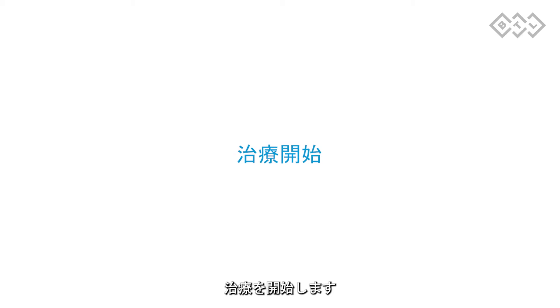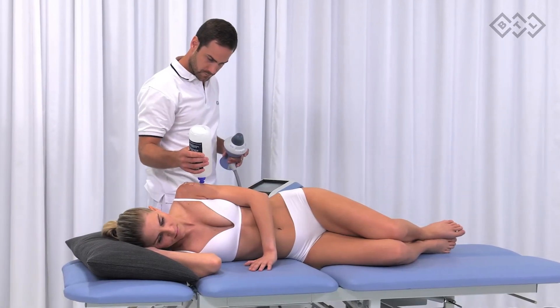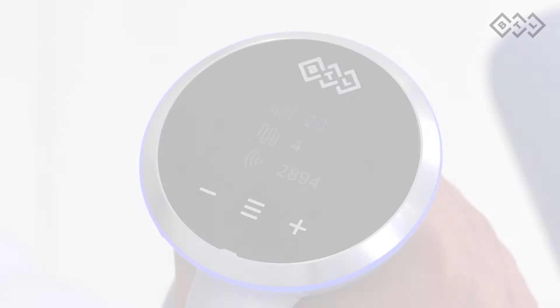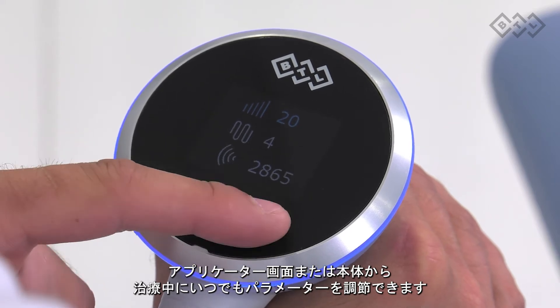Now it is time to start the therapy. Apply sufficient amount of gel in the treated area. Always initiate and finish the therapy outside of the patient's body by using the therapy's start-stop button on the applicator. Initiate the therapy with low intensity and adjust it according to the patient's feedback. You can adjust therapy parameters any time during the therapy on the applicator display or from the main unit.